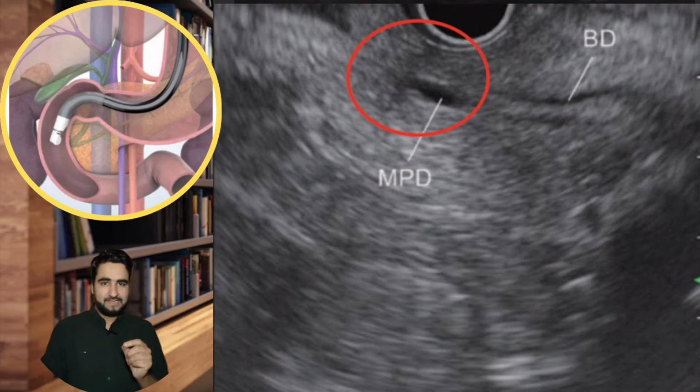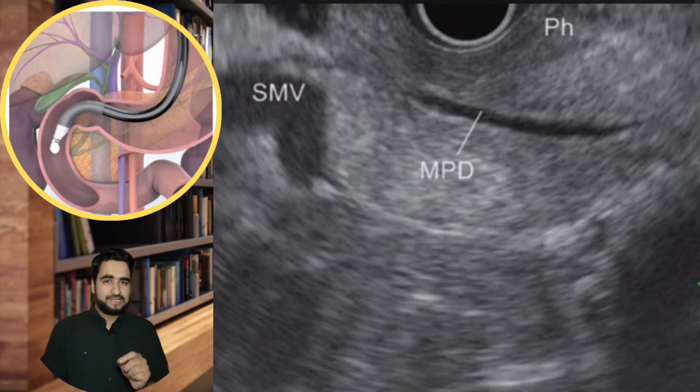After identifying the area of major papilla, that's bile duct and pancreatic duct, turn the scope a little bit clockwise. By doing this, you are actually changing the direction of beams emitted from the transducer from oblique posterior leftward direction to straight leftwards. By doing this, the main pancreatic duct will be imaged in the long axis direction. You can see a prominent anechoic main pancreatic duct in the range of central and shaft beam.